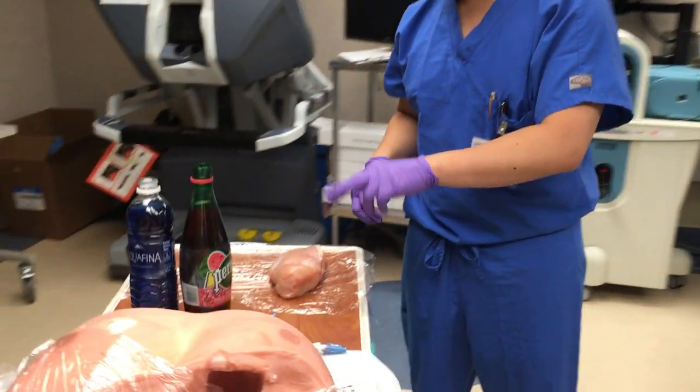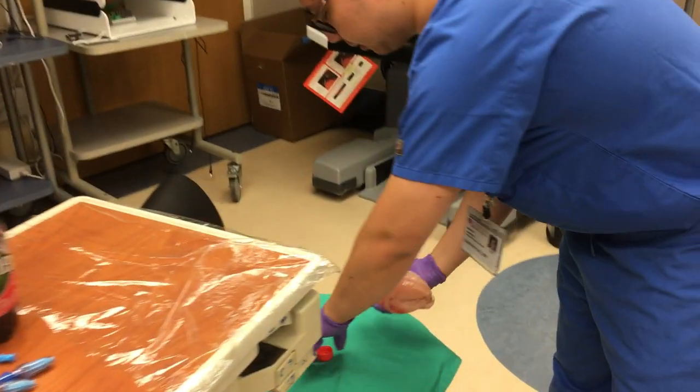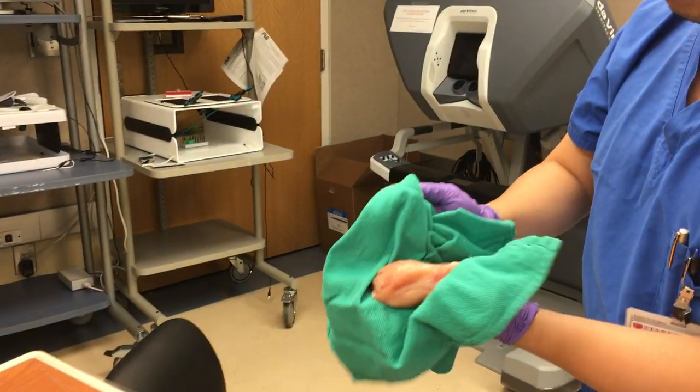Over here, there's a chicken breast. The key is to have it thawed. Step one is to dry it. We would use just a standard towel to dry it — give it a once over.